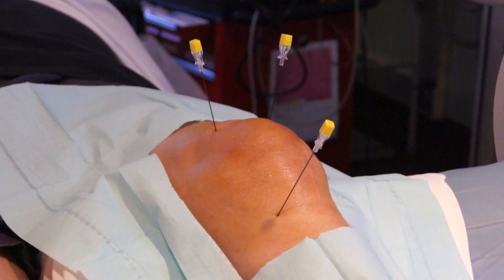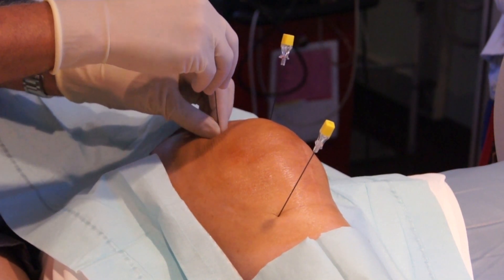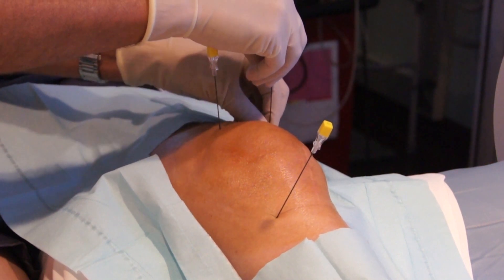The patient is slightly sedated. We now have the needle placed exactly where we wanted it, around the genicular nerves. We are going to perform sensory and motor testing to make sure we are targeting the right nerves, and after that we are going to numb the nerves before performing the radiofrequency energy lesion for cauterization.